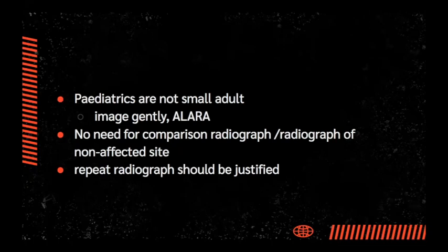Again, there's no need for a comparison radiograph or radiograph of the non-affected side. Usually a radiograph of the affected side is sufficient. If you want to compare, probably compare with other patients of a similar age, as that will be a better way. Most of the time, we don't need a repeat radiograph, but if you really need to repeat any radiograph, it should be justified, perhaps based on the clinical condition.